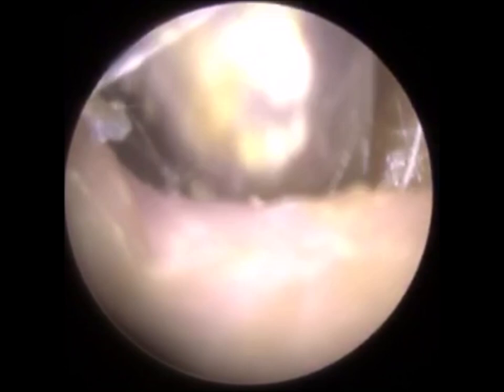So, as with most things, it just takes a while for people to appreciate that actually this has many, many benefits, and not just turn your nose up at something because it's new and novel, and maybe because some people wouldn't be able to perform this procedure. We do find a lot of people who have been using microscopes or head loops for a long, long time tend to struggle at first, and that's because their brain's used to doing it in a certain way. But over time, the majority of specialists, and I wouldn't say everyone, but the majority for sure, who were previously performing microscopic or head loop earwax removal and have come on our course, have now tended to use the endoscope a lot more than the other two techniques.